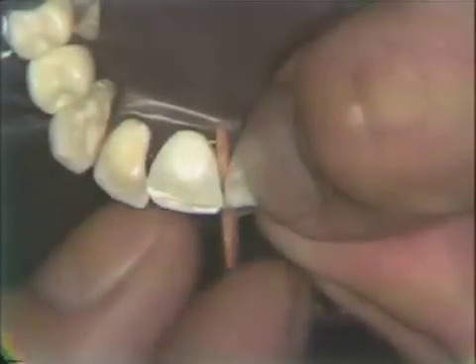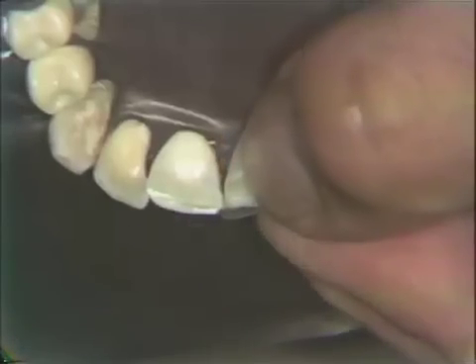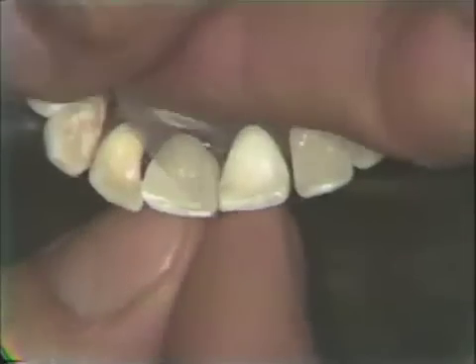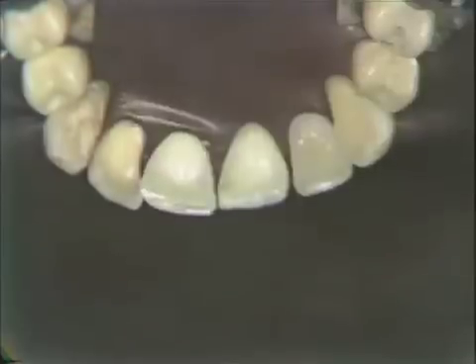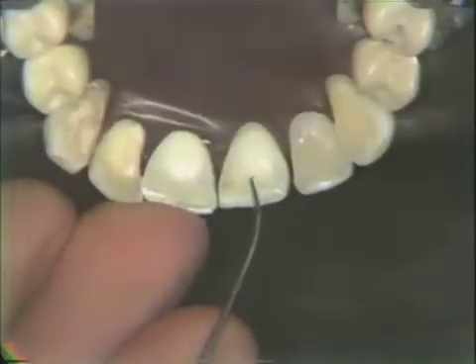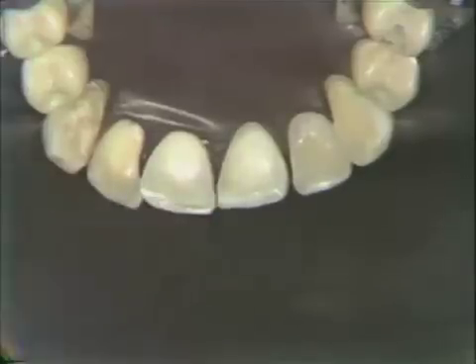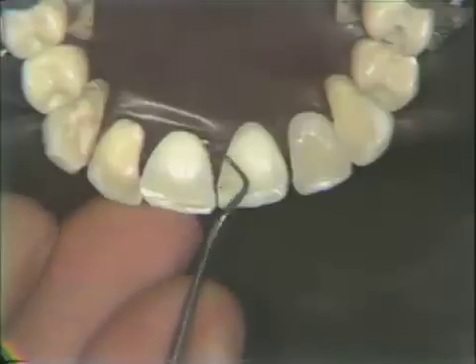After 5 minutes, the wedge is removed. That is 5 minutes from the time you start mixing. The wedge is removed, and the matrix strip is removed. We now wait another 5 minutes before we actually start the finishing. It is well, though, to look at this preparation and see that we do have it filled completely.